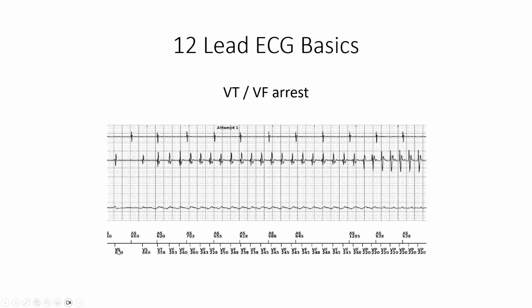He's A-sensed, V-sensed, one-to-one conduction, sinus rhythm, A-sense, V-sense, and then A-sensed here, he has a PVC come in, and it's just like off to the races. This is well over 200 beats a minute.